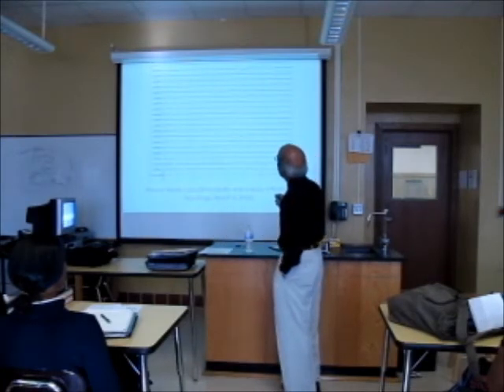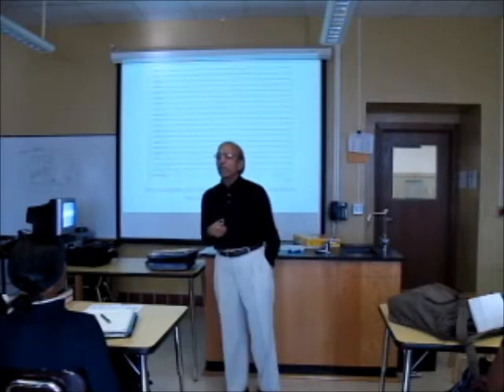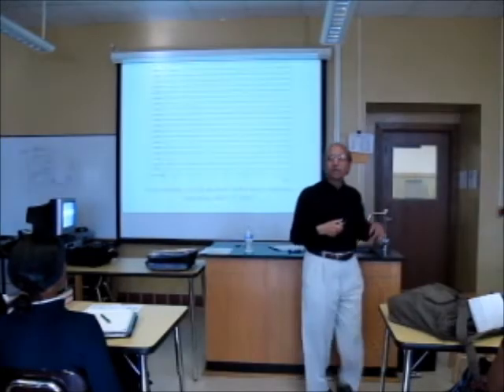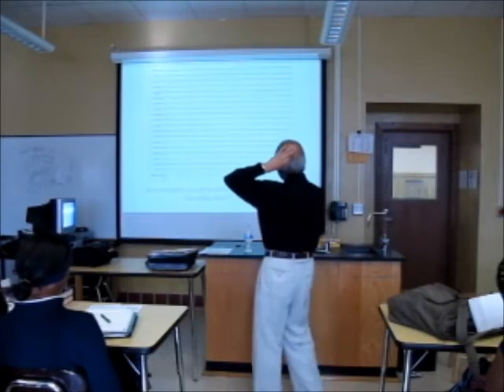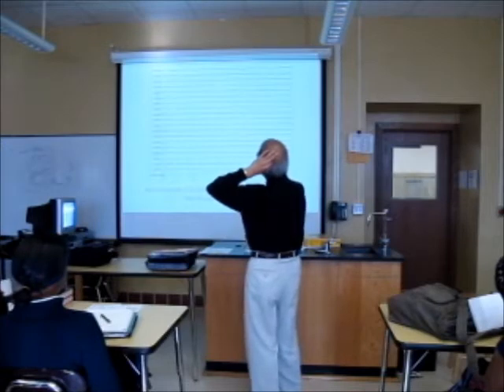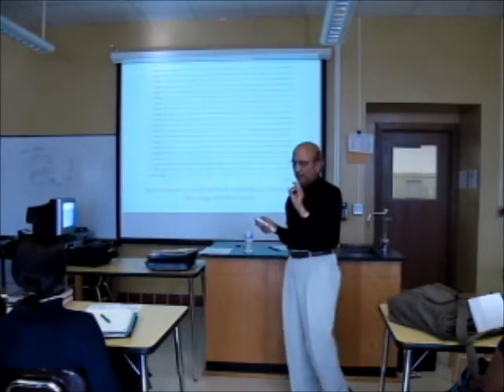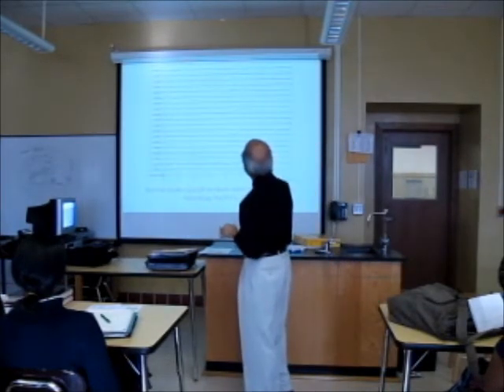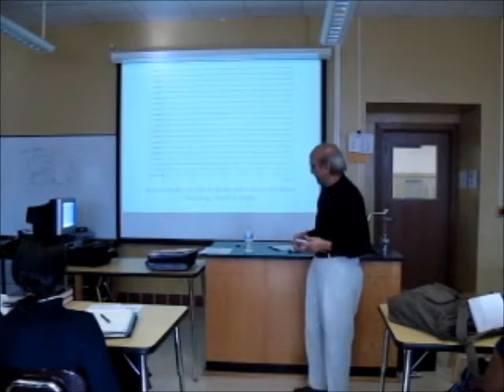And here if you count 1, 2, 3, 4, 5, 6, 7, 8, 9 hertz, that's called alpha activity. And we record alpha activity on the occipital and the parietal lobes. If you compare this with this, it's very similar. And we record this when the patient is lying quiet with the eyes closed. When we open the eyes, see here the eyes are open, okay? Alpha activity disappears.